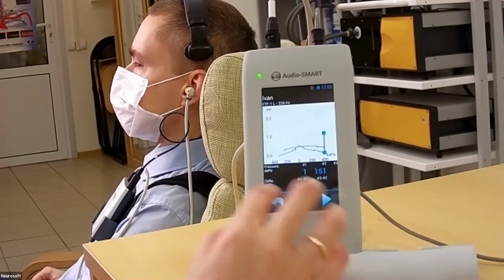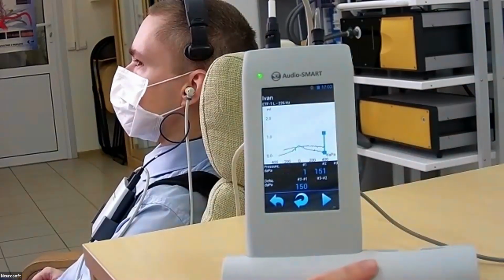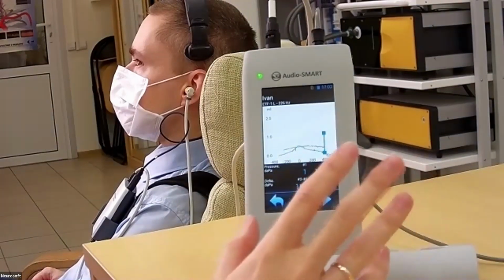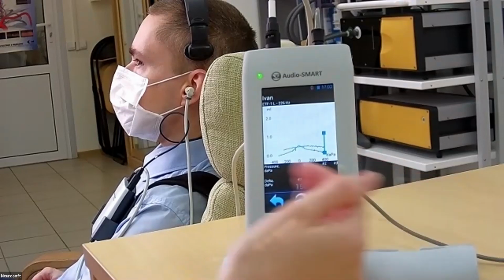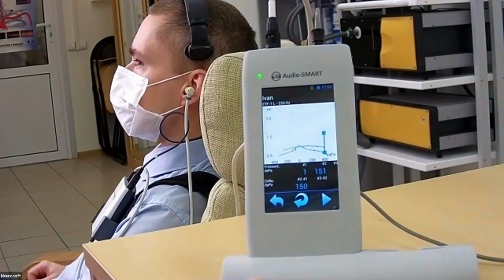One more time, our peak is out of the values. So let's go to the Toynbee maneuver, and the peak will come to our values again.